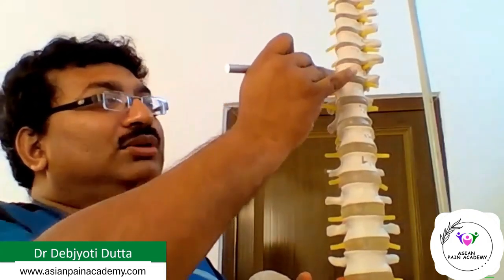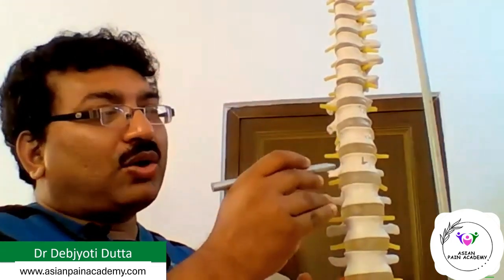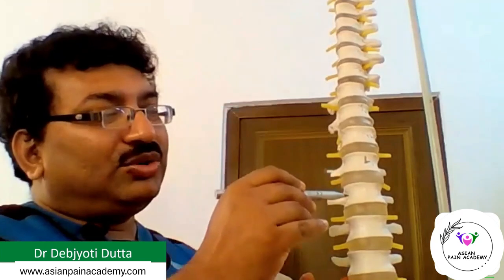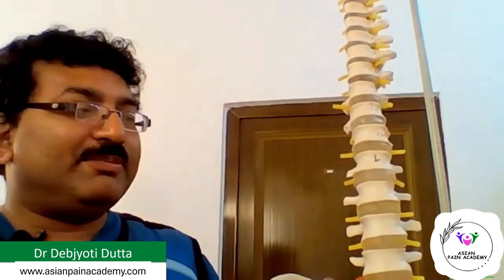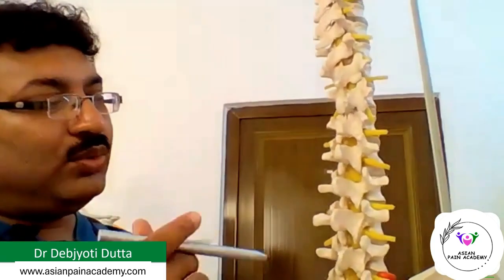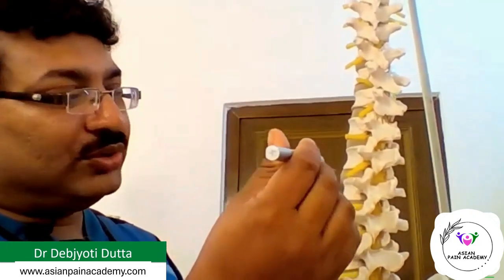As we are coming down at the lumbar area, it is situated at the anterolateral corner of the vertebral body. So from behind, it is coming towards the anterolateral side, and then, as you all know, the chains of both sides join together below, forming the ganglion impar. So to block at the lumbar sympathetic level, we need to go to the anterolateral corner of the vertebra. Now, if we think that we are coming from the back, how can we see what structures we have to go through and where we need to go.